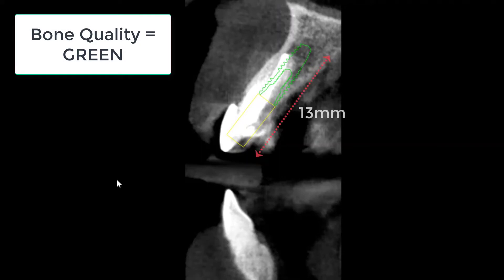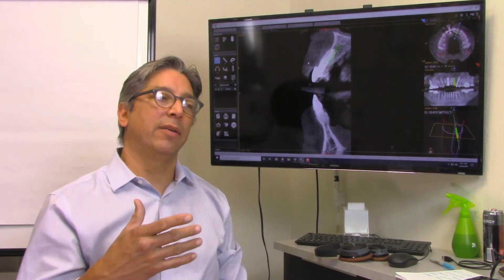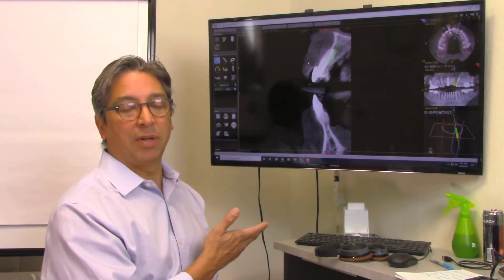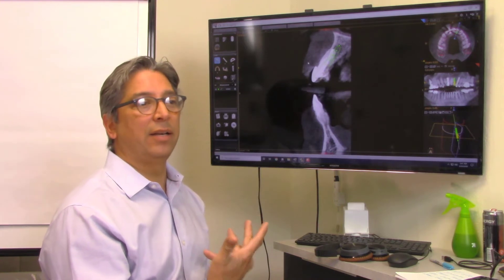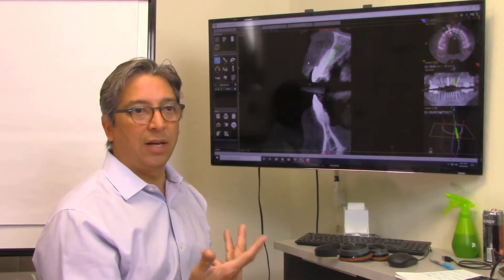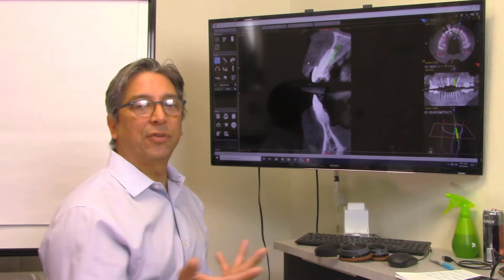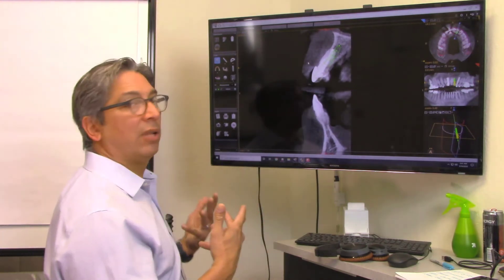This is a 13 millimeter implant that I placed here. I know I could get a good four millimeters of bone past the apex of the socket — just over four millimeters on measurement. You want four millimeters of implant purchase. If you have a system with a 16 millimeter length available, that could give even more stability, but I don't normally use a 16 — maybe a couple times in 18 years. Thirteen is enough. That four millimeters is enough, and remember you have adjacent walls mesially and distally in the socket that will help stabilize it.